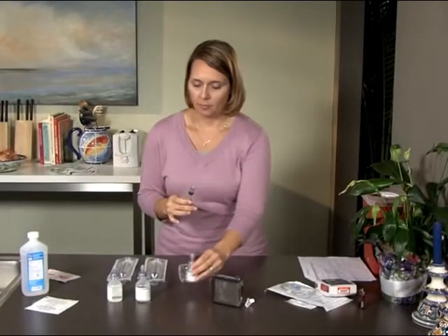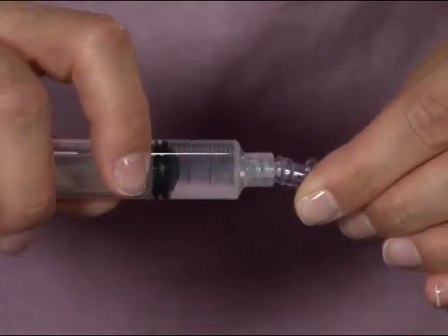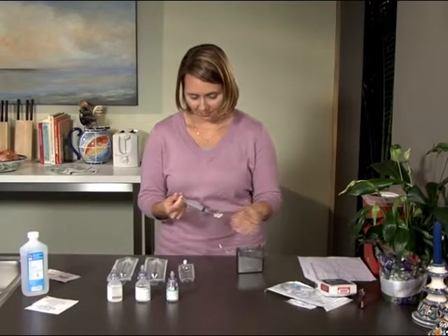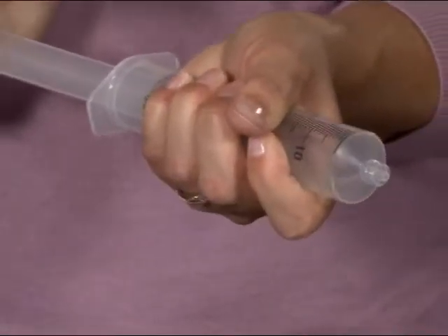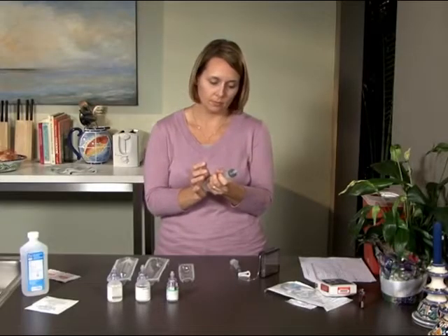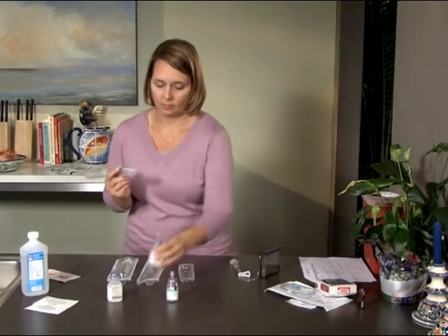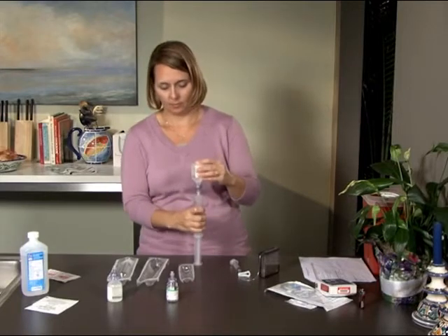Remove the syringe. Take the cassette tubing and remove the blue cap. Twist the 3ml syringe onto the cassette tubing and push the plunger to release the Remodulin into the cassette. Clamp the tubing, leaving the syringe attached. Next, you'll need to determine how much diluent you need: subtract the amount of Remodulin you just injected into the cassette from 50ml. For example, if you used 2ml of Remodulin, the amount of diluent you will need is 48ml. Once you know how much diluent you need, take one of the 60ml syringes and draw up air into the syringe for the amount you calculated. Then twist the syringe onto the vial of diluent and push the plunger to release the air into the vial.